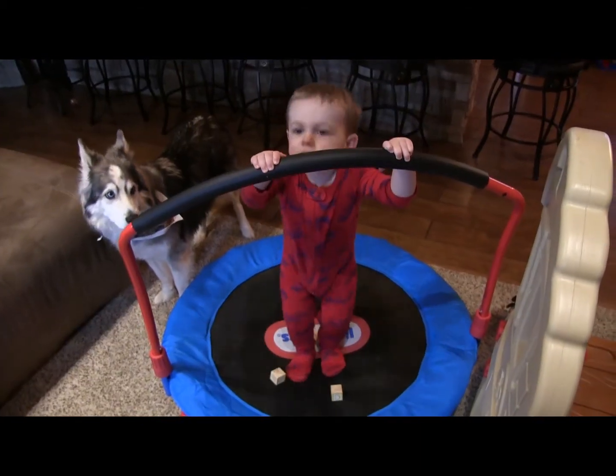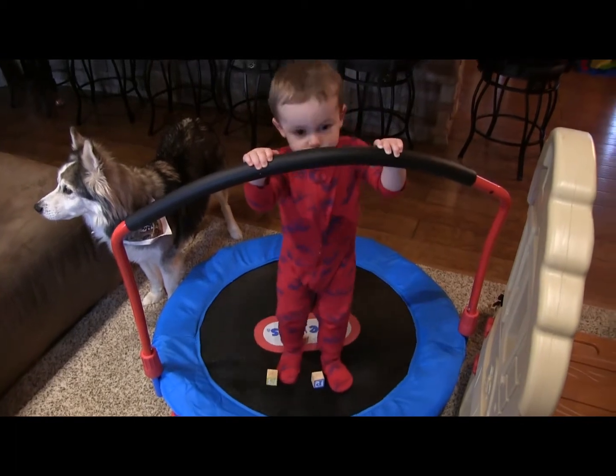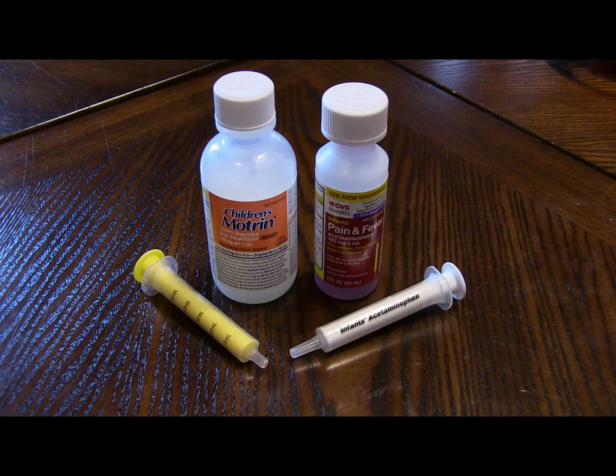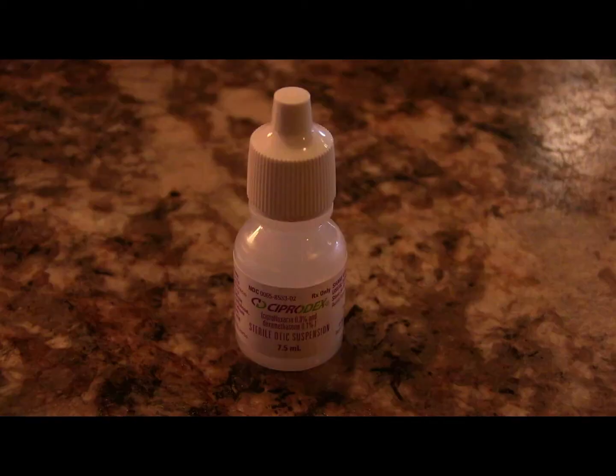It is also very important to avoid physical activity for 24 hours after your surgery, as it could dislodge the tube from your ear. If you were to experience discomfort after this procedure is done, Tylenol and Motrin should relieve the discomfort. Be sure to follow dosing instructions from your physician. Under certain circumstances, antibiotic eardrops may be needed.